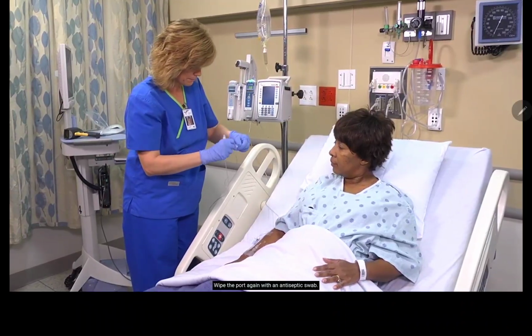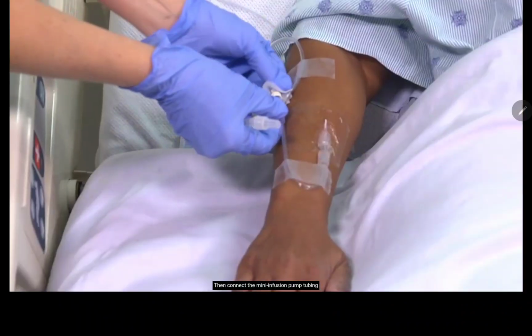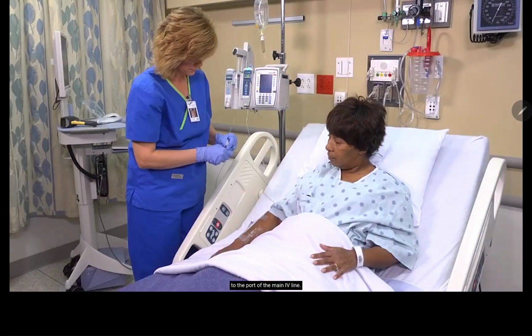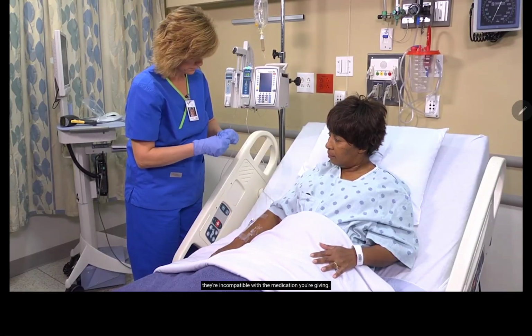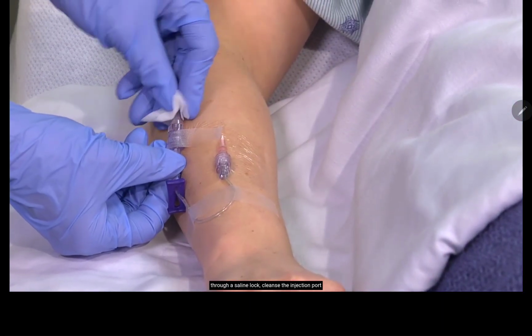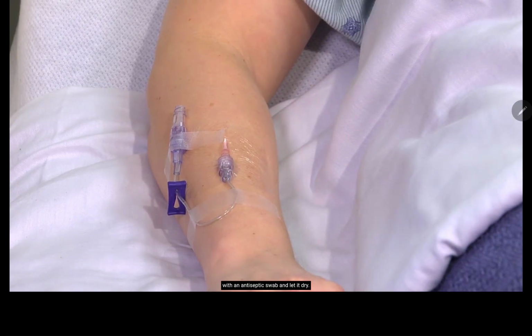Wipe the port again with an antiseptic swab. Then connect the mini infusion pump tubing to the port of the main IV line. It's not necessary to turn off the running IV fluids unless they're incompatible with the medication you're giving. If you're delivering the IV medication through a saline lock, cleanse the injection port with an antiseptic swab and let it dry.